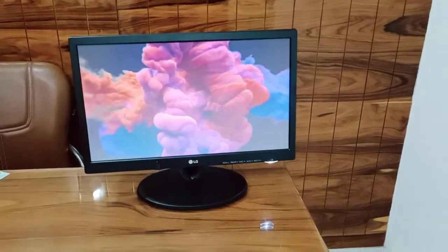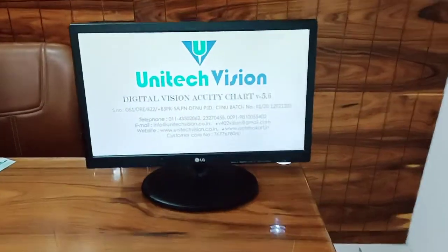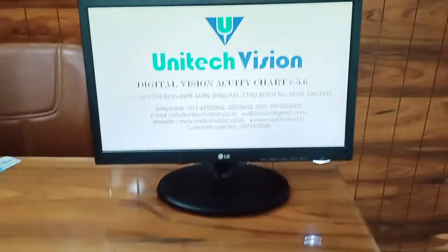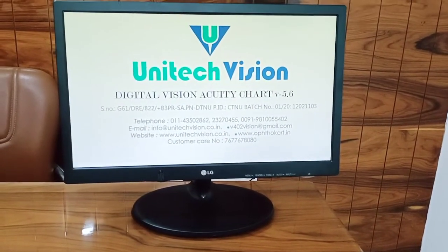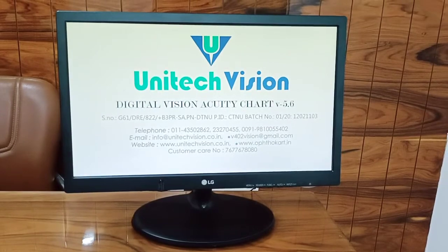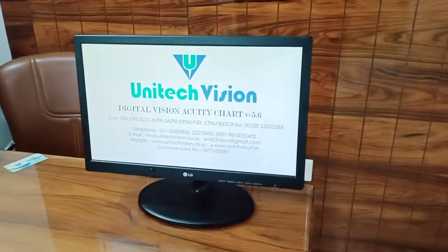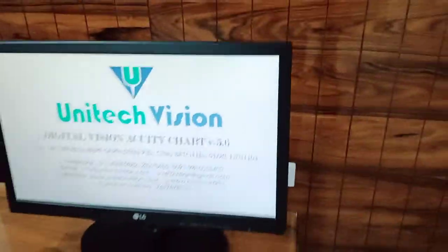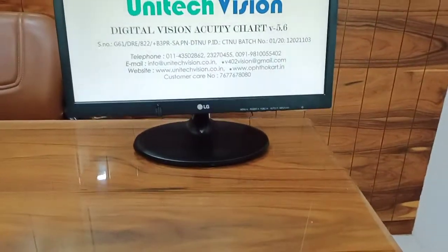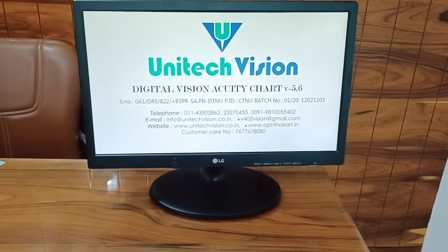Hello friends, presenting in front of you a 19 inch digital acuity chart with LG monitor, made by Unitec Vision. This chart you can use very easily. You can put it on the table like this, or hang it on the wall also.